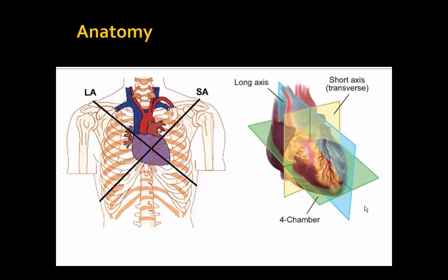And you'll see that. And really what makes the most sense of this is really just pattern recognition and repetition. Twisting your brain around and trying to wrap it around how you're viewing the heart is kind of difficult when you're beginning. So really recognize, when the probe goes here, this is what the image should look like roughly, and that is easier for you than trying to build this model in your brain at the beginning.